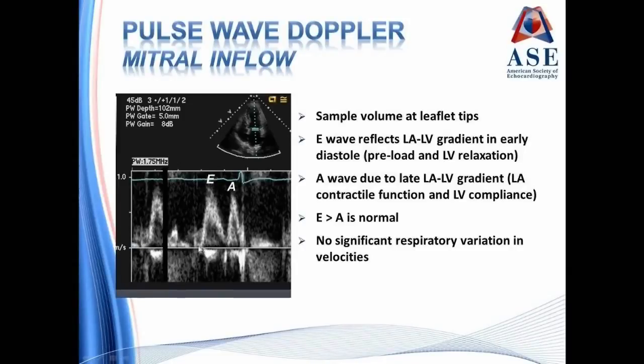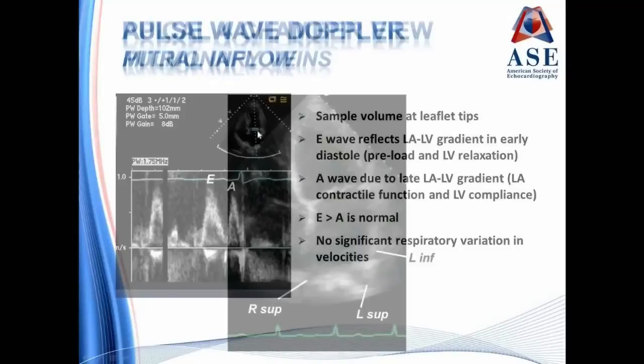You'll also notice that this is laminar flow, meaning that all of the blood cells are moving at the modal velocity, indicated by there being no signal or not much of a signal here. All the red blood cells are moving in the same direction and at the same velocity, making this laminar flow and normal filling of the left ventricle.